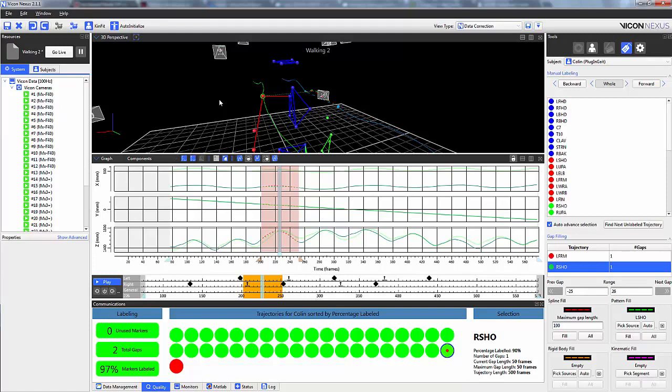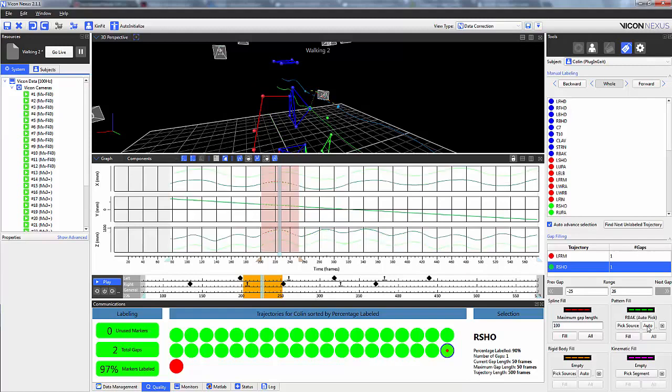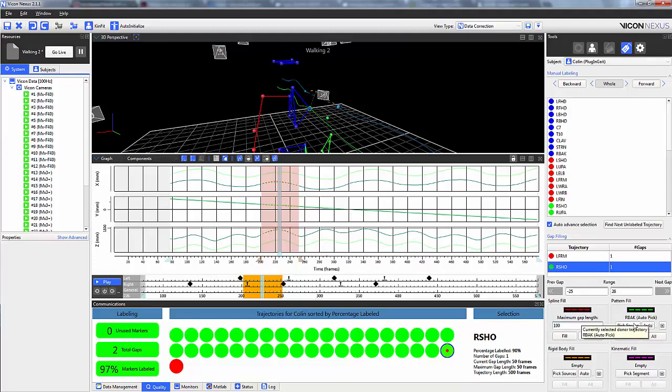The same color scheme applies for the rigid body fill and the kinematic fill. If I press the auto button, we can see that the algorithm chooses the right back marker, and this better represents the movement of the missing right shoulder marker.